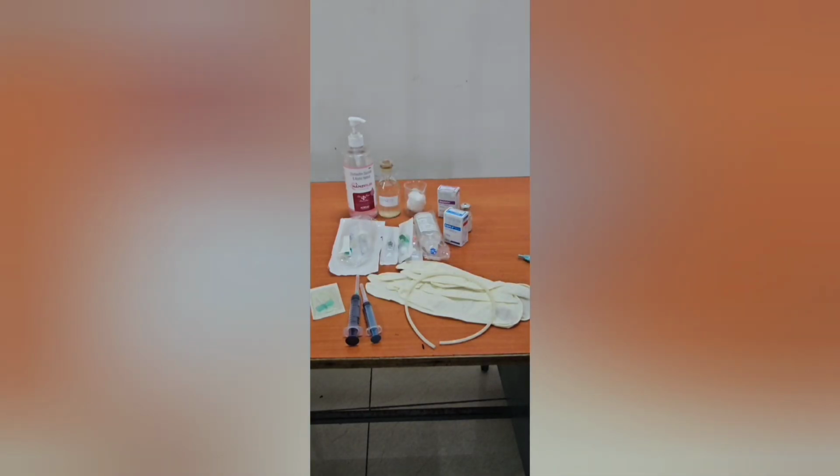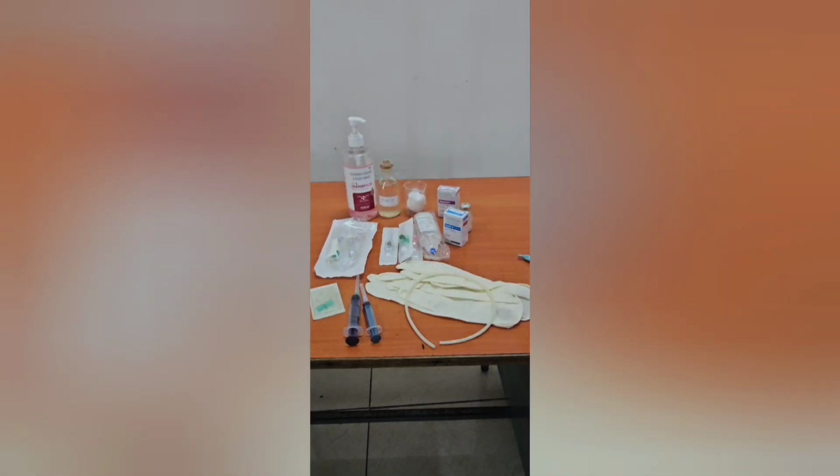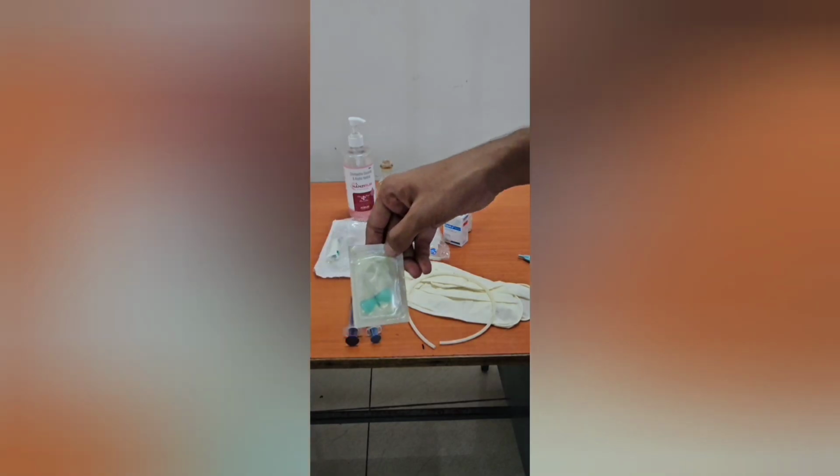Then we'll be using an IV drip set and Venflons. There are two types of Venflons, a regular Venflon and a butterfly Venflon for emergencies.